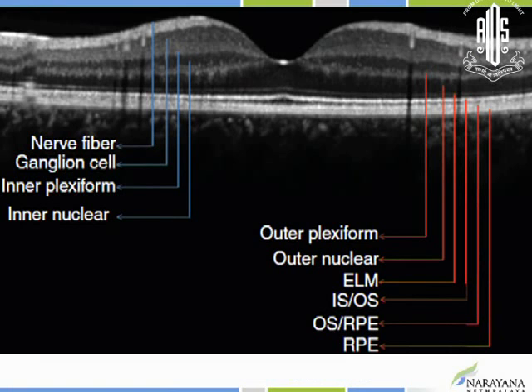So the first thing I want to bring to your light is that we know this adult OCT picture so well. We know the layers, we know what's inner and outer retina, marked in blue and red here. But it's interesting to know that infant OCT is not the same. All of us, especially if born premature, don't have the OCTs of, let's say, adults like our parents. That's something I want to bring here too.